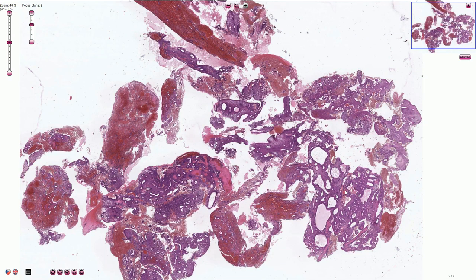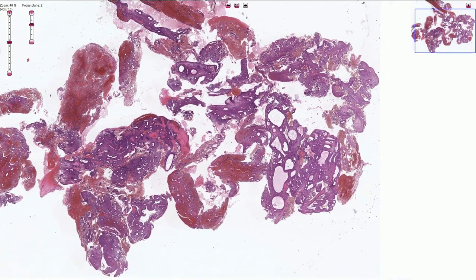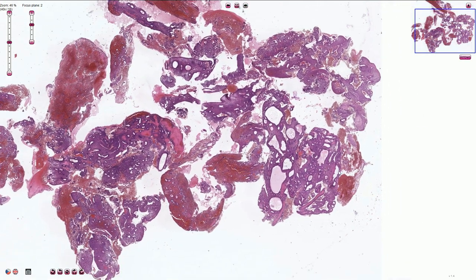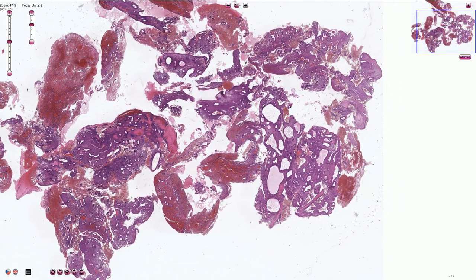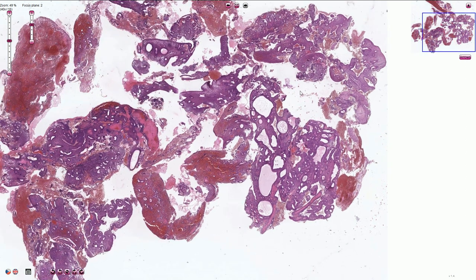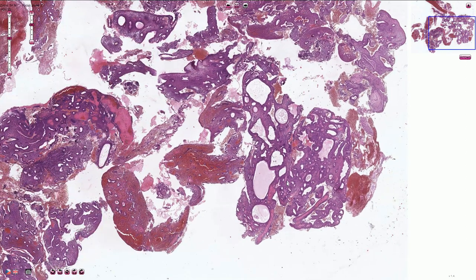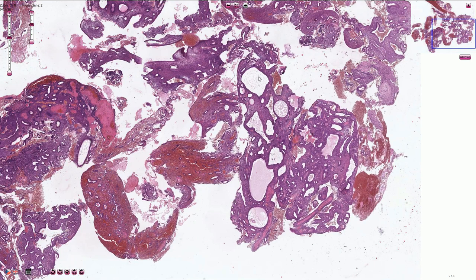Morphologically we see proliferation of the endometrial glands with an increased gland to stroma ratio. In this part of the picture we can see quite a lot of endometrial glands, some of them associated with dilation and quite a small amount of endometrial stroma.